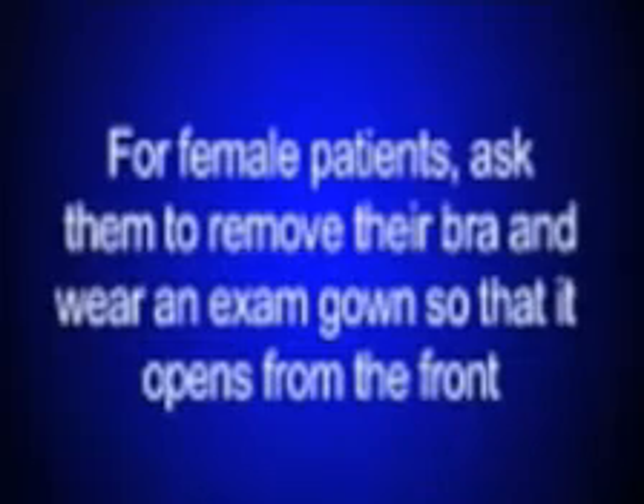To prepare your patient for Holter monitoring, they must be undressed from the waist up and sitting or standing upright. For female patients, ask them to remove their bra and wear an exam gown so that it opens from the front. Prior to electrode placement, have the patient remove their cell phone from the preparation area and any heavy jewelry.